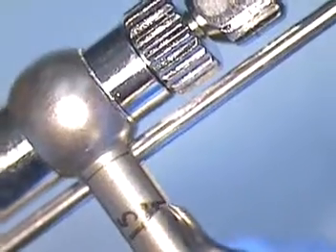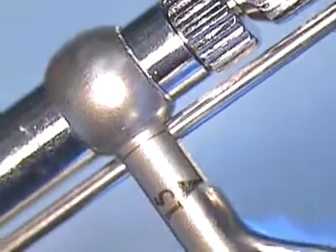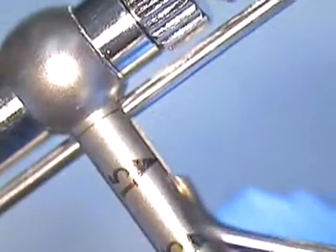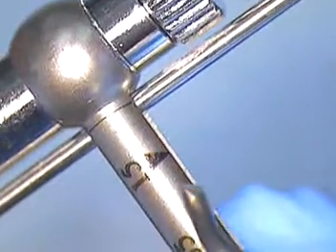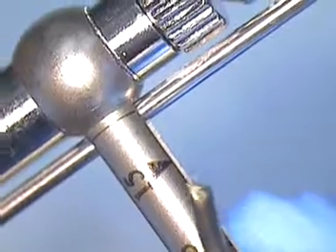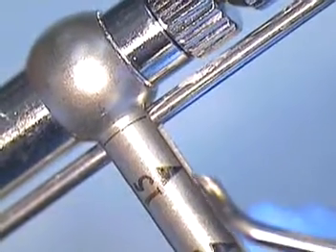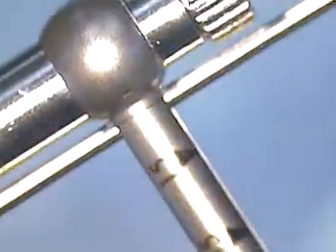Between 15 and 20 is all you really need. It's almost hand tightening. Anything beyond that, you're going to have a problem with threads eventually, if not the top of the screw head. But it's a lot easier to go back in and re-tighten something that's still in good condition, versus something that's broken off or stripped. So take note of the newer drivers.